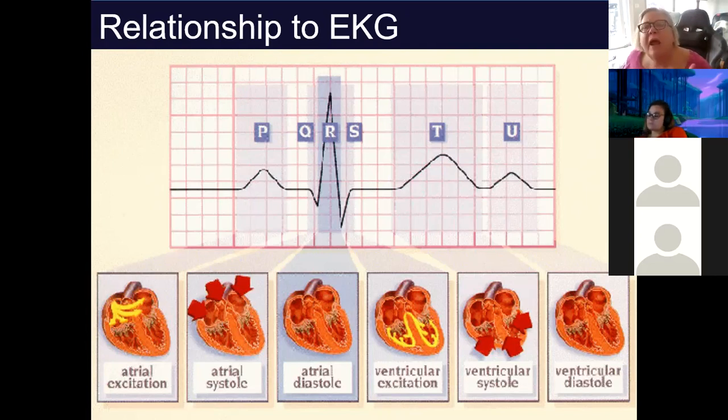So we've talked about how with ischemia and potential myocardial infarction, we talk about ST depression, ST elevation, and flipped T waves. When we talk about flipped T waves, it's always in the opposite direction of how the P is going. So if you have an upright P, you should have an upright T. P meaning Peter, T meaning Tom.